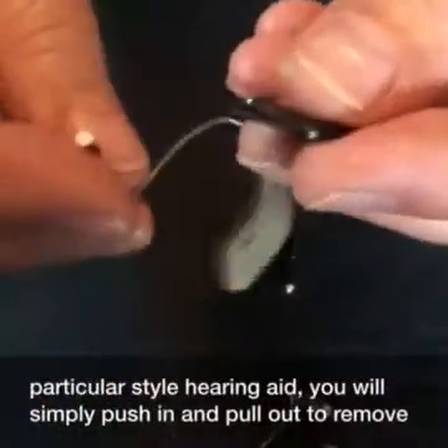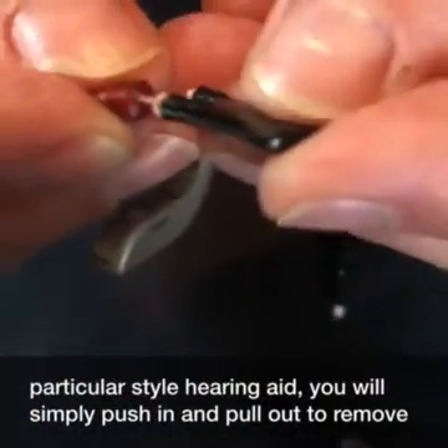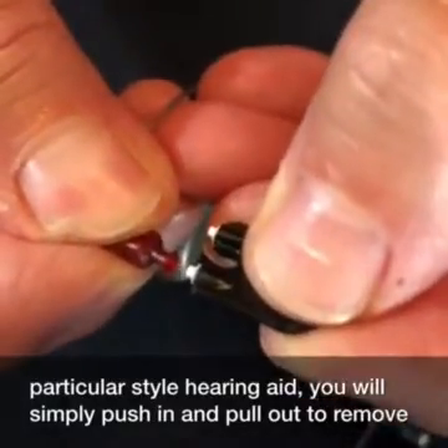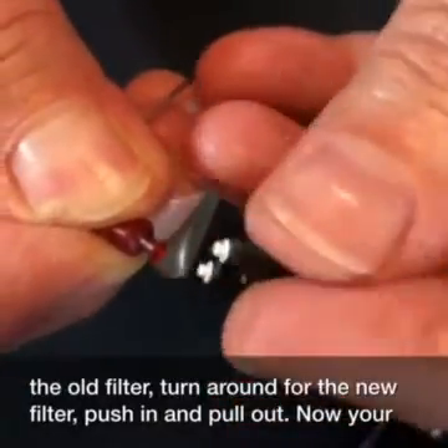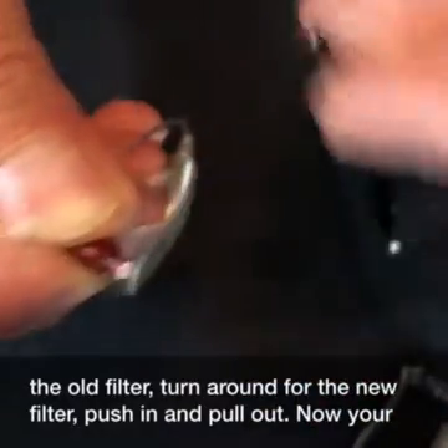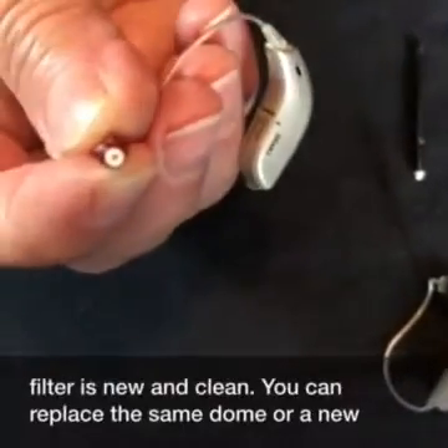For this particular style hearing aid, you will simply push in and pull out to remove the old filter. Turn around for the new filter. Push in and pull out. Now your filter is new and clean.